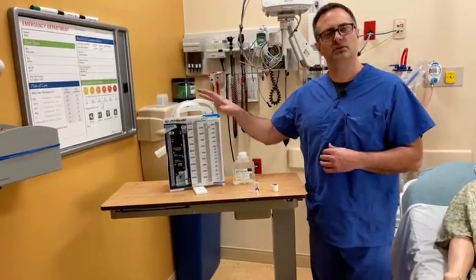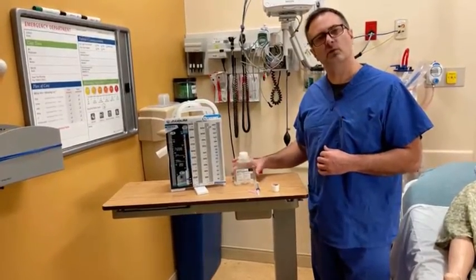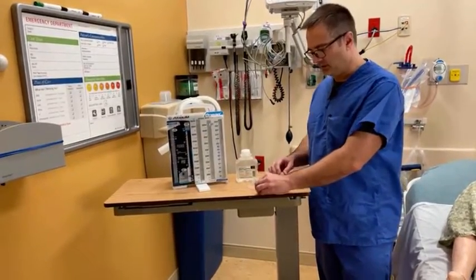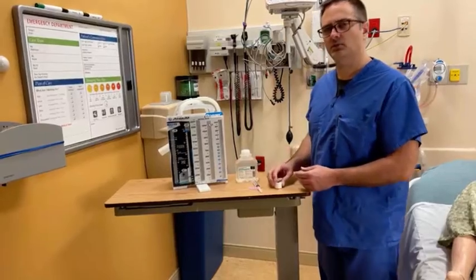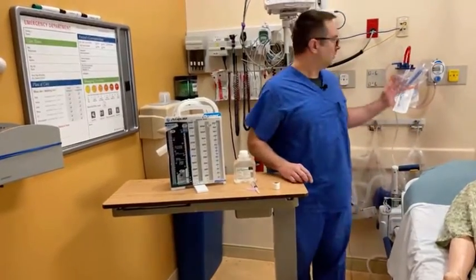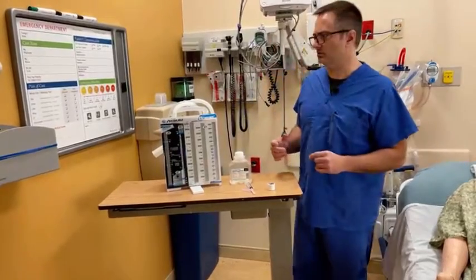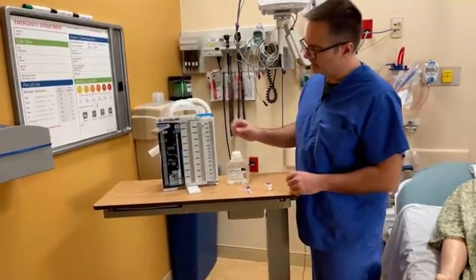We'll of course need our chest drain system, a source of sterile water, a syringe with a 20 or 22 gauge needle, a source of tape, as well as suction, whether it be wall-mounted or portable. Once we have those supplies, let's turn our attention to the components of the chest drain.